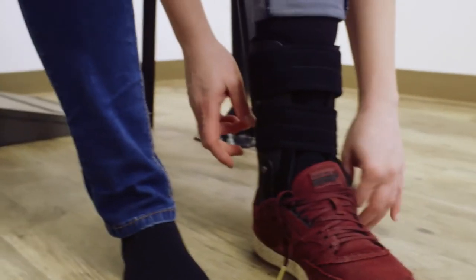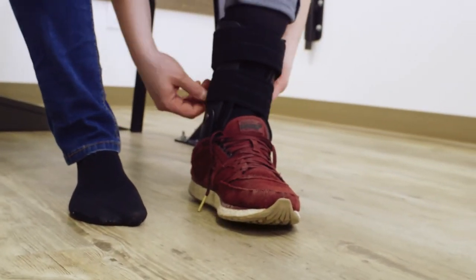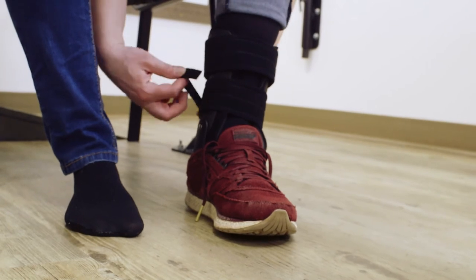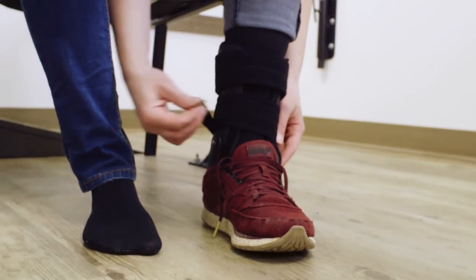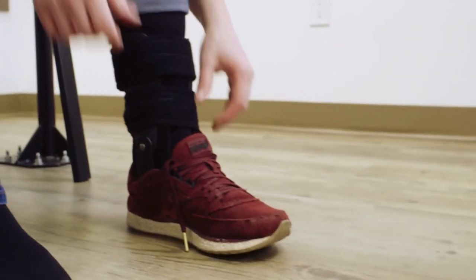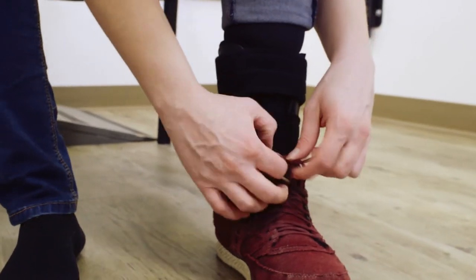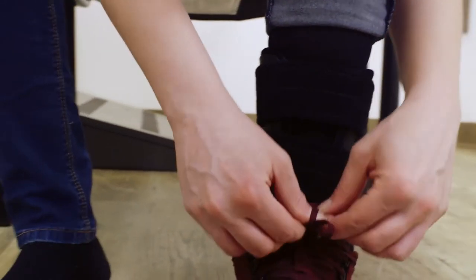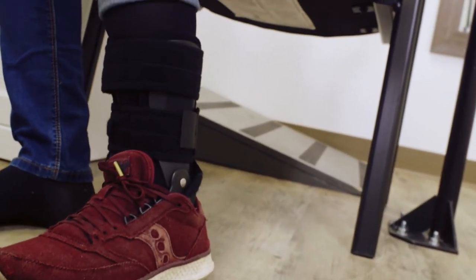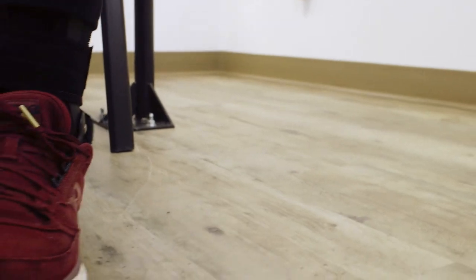So it's done up like that, and then this little extra piece here just wraps around nicely around the back — it's just a little bit of support around the back of the ankle. You just want to have it loosely done up like so. You can see it is a bit bulky in this shoe. It is designed mostly for athletic shoes like court shoes for sports such as volleyball and basketball, but it does provide quite a bit of side-to-side stability and works quite well.